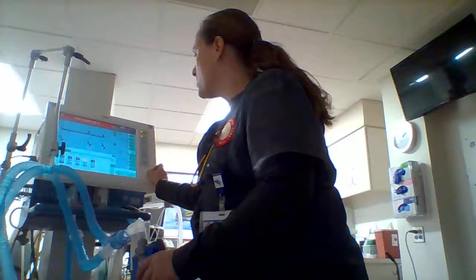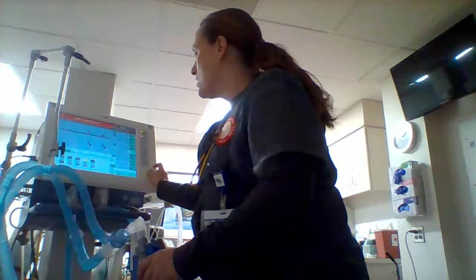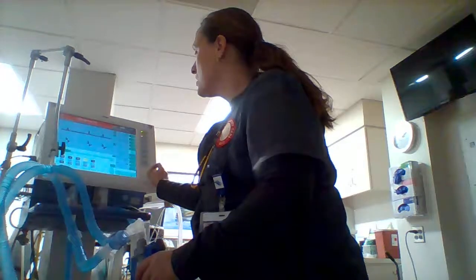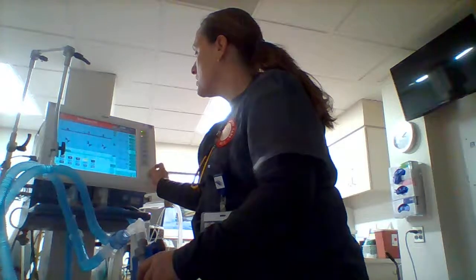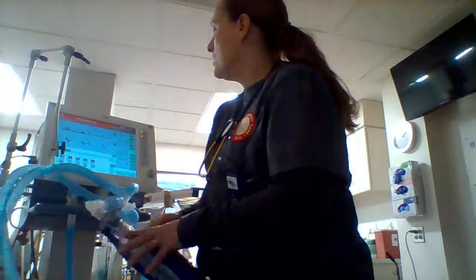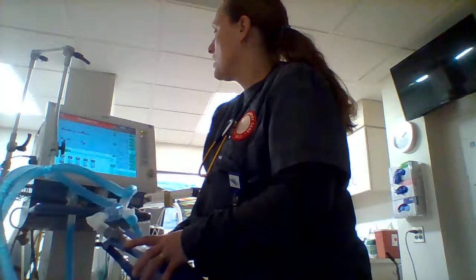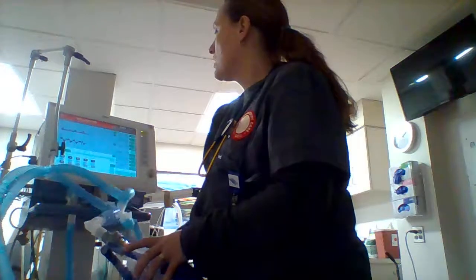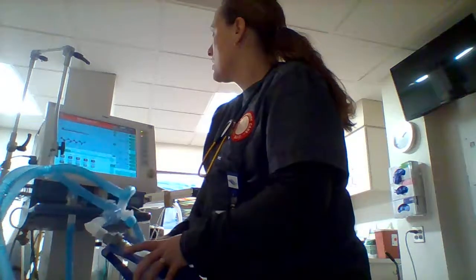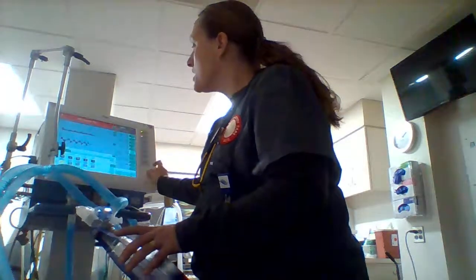She's breathing 30 times a minute, so let's look at the rate alarm. The rule is about 10 over, but that's really high — let's set it at 35. And the I:E ratio alarm — 2.8, let's make it 3.0.